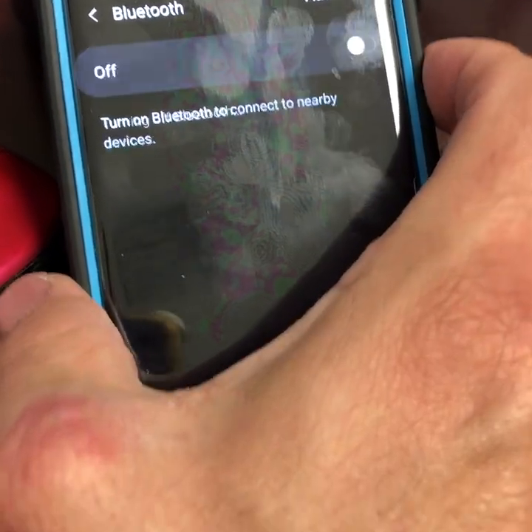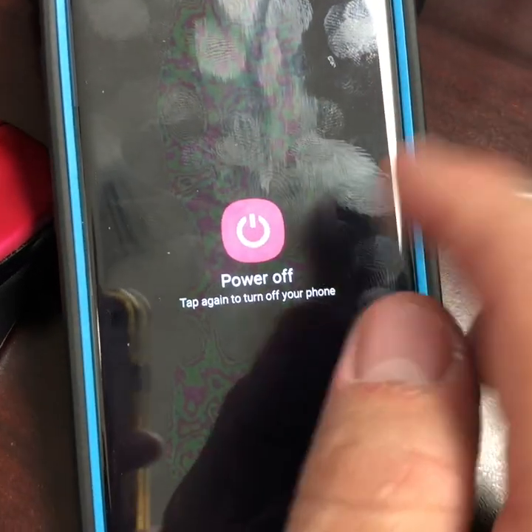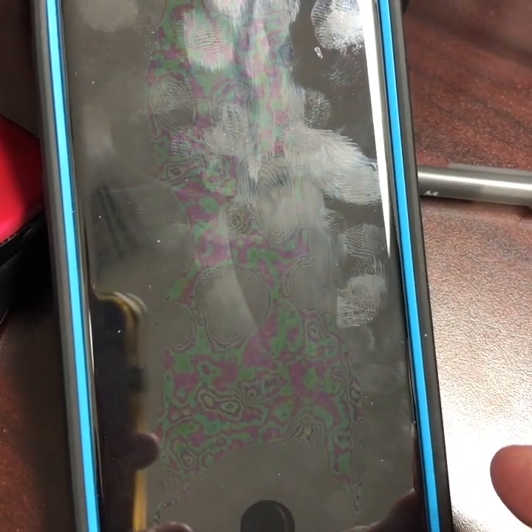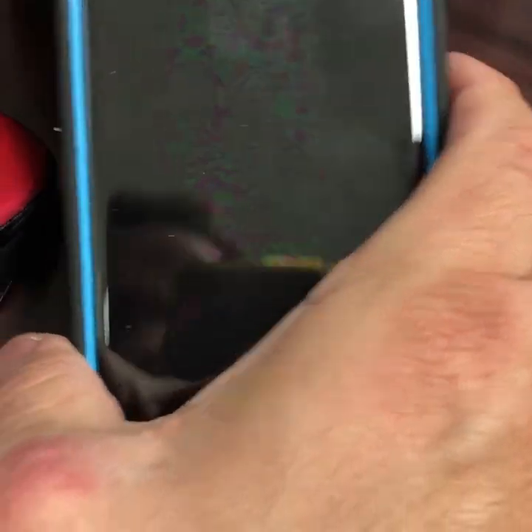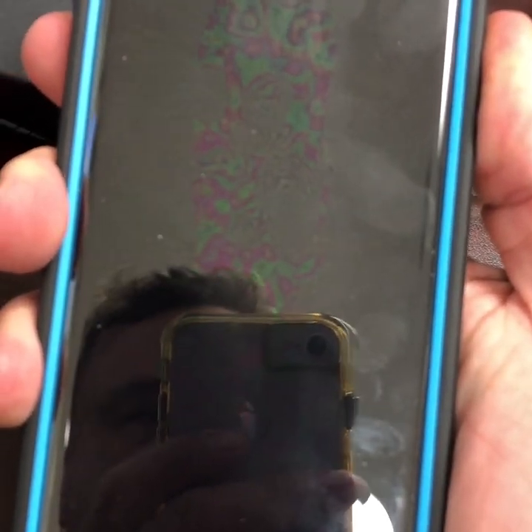If you've already tried this, un-pair the hearing aids, then turn off the Bluetooth and power down the Android phone. Put your hearing aids in the charging cradle, or open the battery door to turn them off.